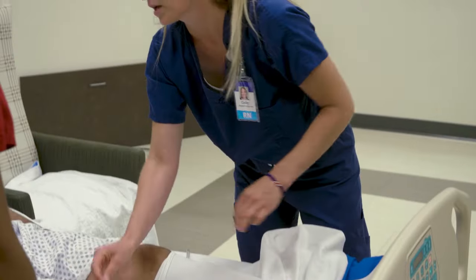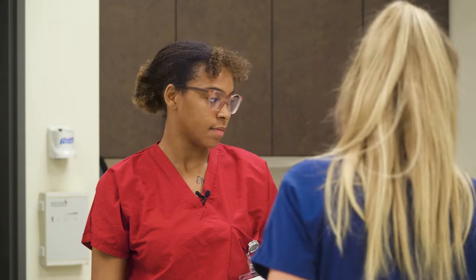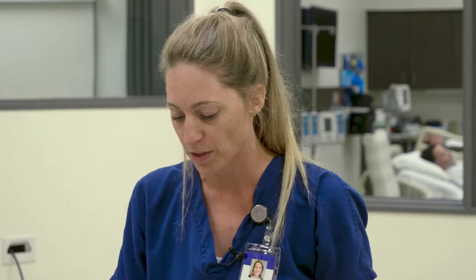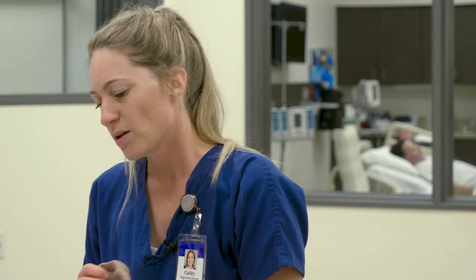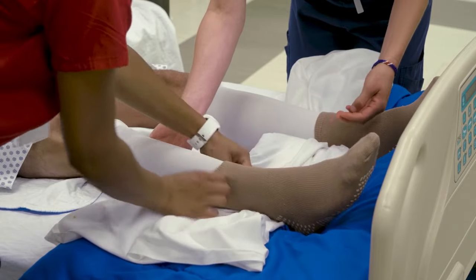It's really important that we get the TED hose, the compression hose, on first thing in the morning before you get up. It's also important to wear socks that have treads because it can be really slippery. You can either wear socks or shoes so that you don't fall.